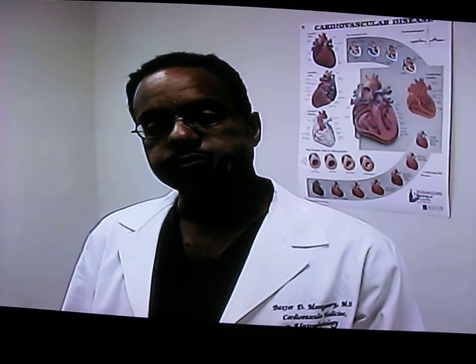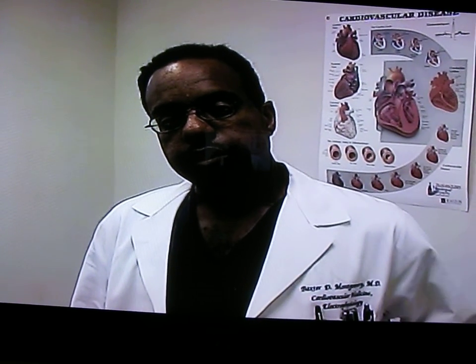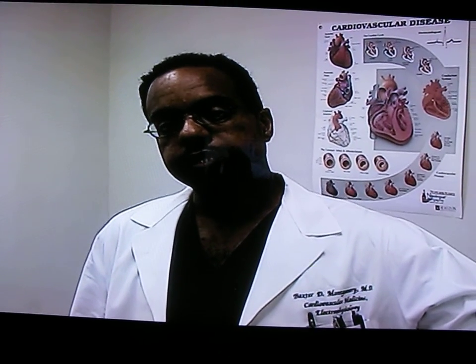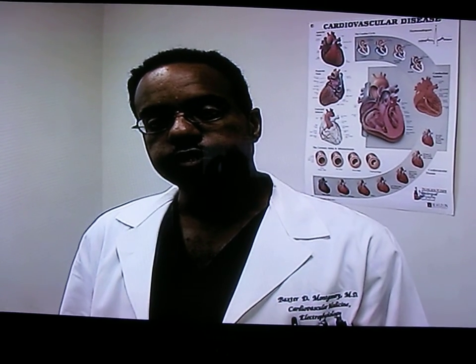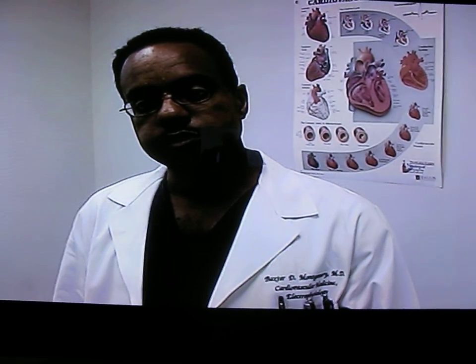So just first glance, what would that mean to a doctor though, to have the baseline that's clearer as opposed to one that's not as clear? Yeah. The ability to interpret the findings, I think, is pretty important. So clearly, if you're trying to make a reading of stress test findings, picking up ischemia, even arrhythmias can make a difference. PR intervals, QT intervals, ST segment abnormalities, that's always a clear importance. So, at first glance, that's something that is important, and I think that's something we should look into further.